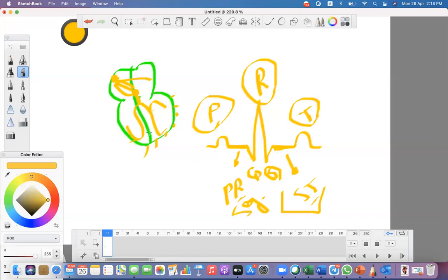Okay. In this scenario, there is something missing, which is, yes, as you said, atrial relaxation. Where is the wave of atrial relaxation? As you know, atrial relaxation occurs at the time of ventricular contraction or ventricular depolarization.